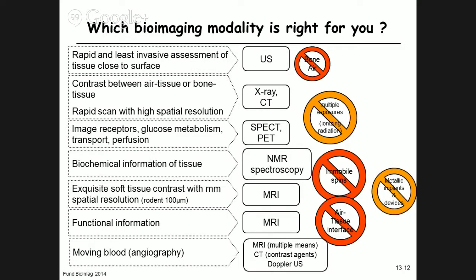But you don't want to go into an MRI if you have a metallic implant or some medical device in your body. And we've talked about when you visited the lab, examples are pacemakers, aneurysm stents, so metallic clips that solidify a blood vessel. Those are the absolute no-nos for going into an MRI scan.